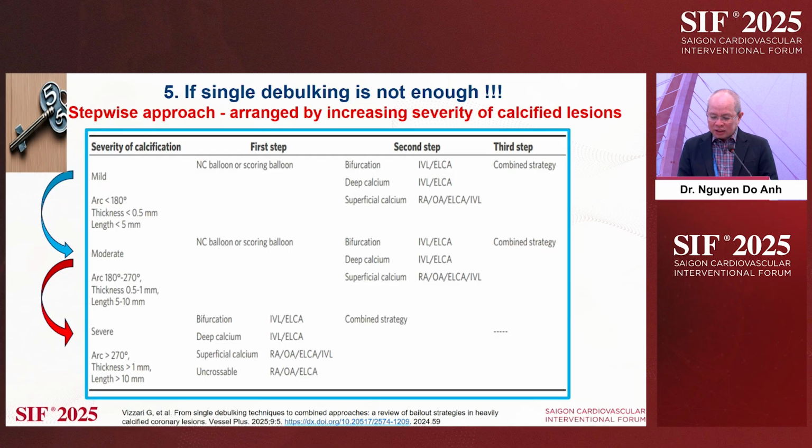Next, in some cases a single technique is insufficient, particularly for extremely calcified or mixed morphology lesions. So in this situation, a combined approach is frequently needed.